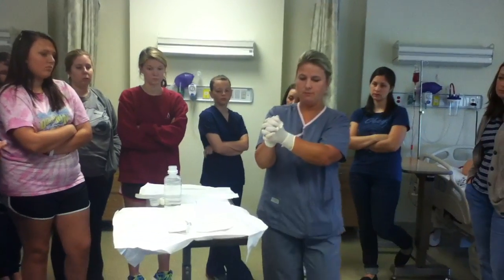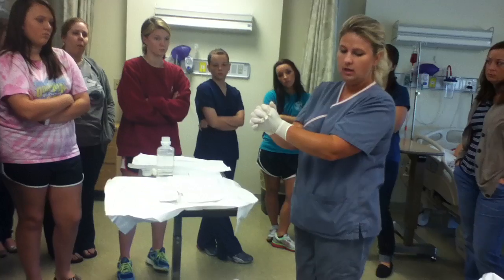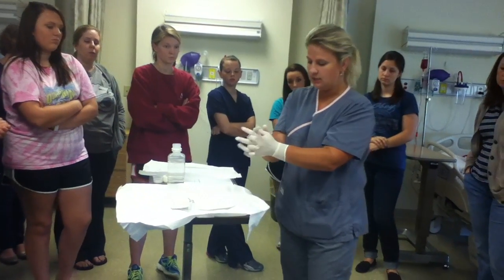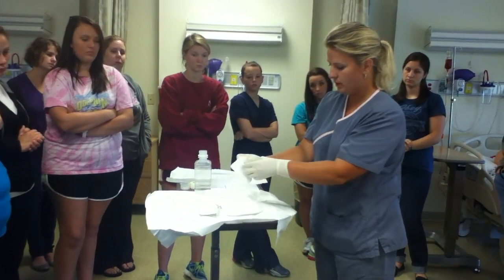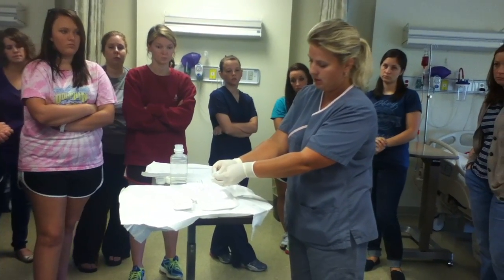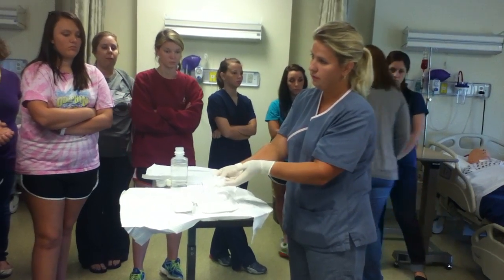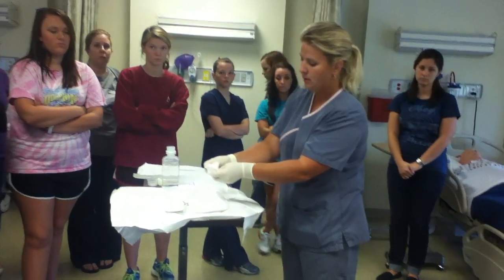Okay, so now, see, I'm just kind of keeping my hands in front of me so I can watch them, interlocked. Now what I'm ready to do is I'm going to clean my wound, okay? So what you're going to have to do is you have to pick them up, you have to lightly squeeze them out. Keep them over your tray because, again, water on your sterile field is going to contaminate it.